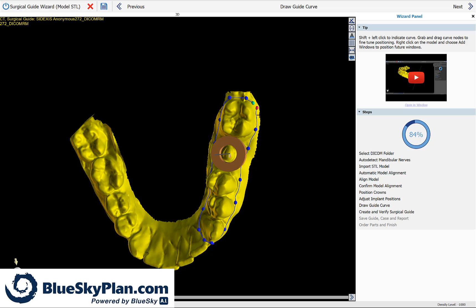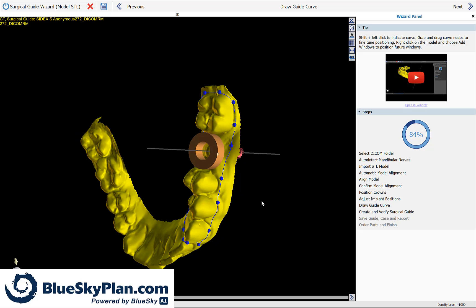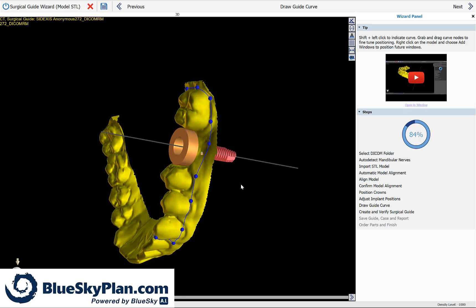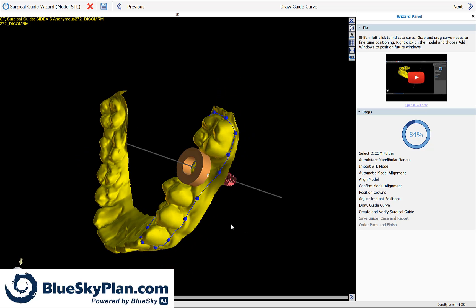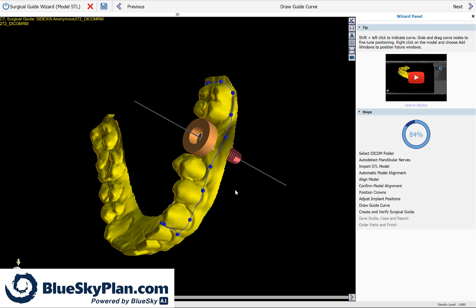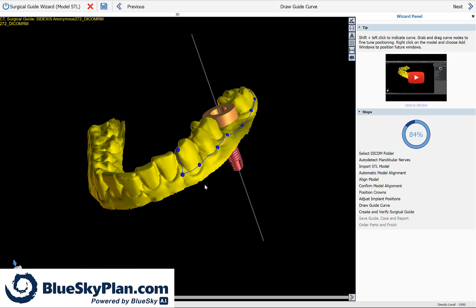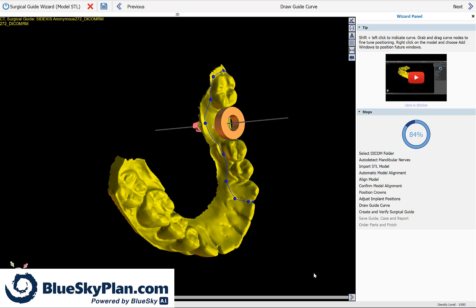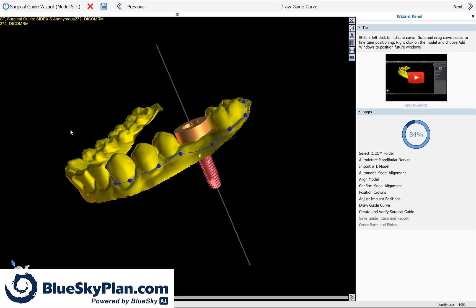When you get to the end, simply grab the green node to the start point, let go. The software will merge them together. At this point, you could review the surgical guide curve to make sure it's continuous and placed exactly how you would like it placed. Once you've completed drawing the surgical guide curve, simply click next.